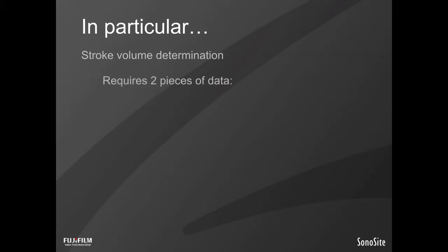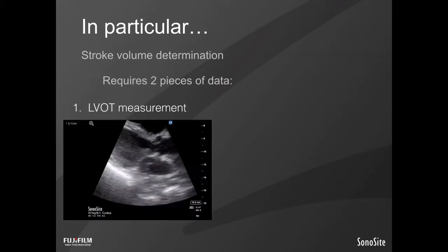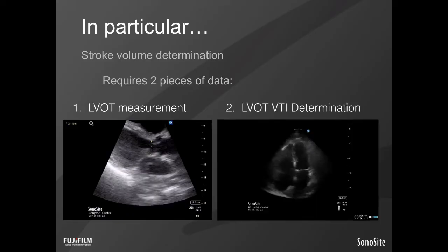So we need to review how you do this briefly. Now, this webinar cannot cover this in full detail. That's a tutorial in its own right. But just to remind you or prep you for the learning you may yet do, you need the LVOT diameter, which is captured in the parasternal long axis. Most people is 2 centimeters plus or minus 0.2 centimeters.